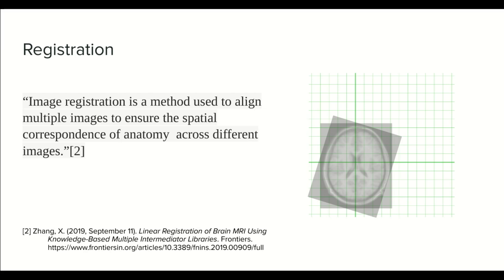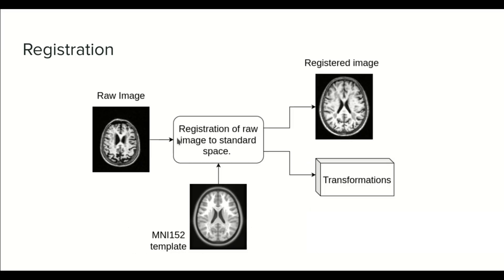So let's see how it works. Now we're going to do registration of a raw image to a template image. Remember, as in the histogram matching step, we need an image as a reference to do the registration. For registration it is usually a template, but it could be any image that you define as a standard.